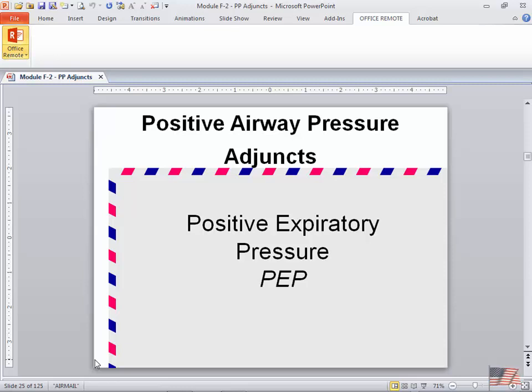Certainly over the summer, but I don't think we do it in here at all. But one of the things that Lori will have available and Amber will have available is a mouthpiece and a filter, so you can put yourself on CPAP and feel the odd feeling that is there. But again, it's odd simply because our FRC is normal.